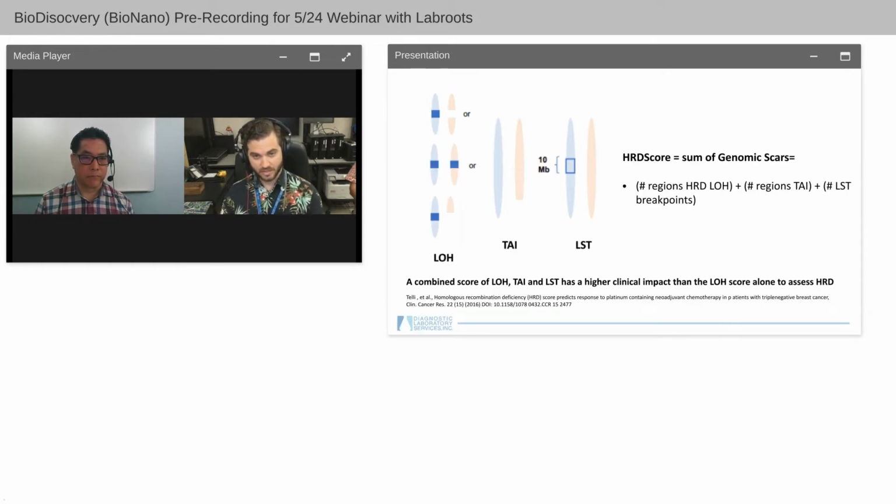As you see, when we want to find the sum of the GIS, the genomic instability, and in our sense, we call it the HRD scoring, we need to add up all of these together and basically also assess them as they are now aggregating together.